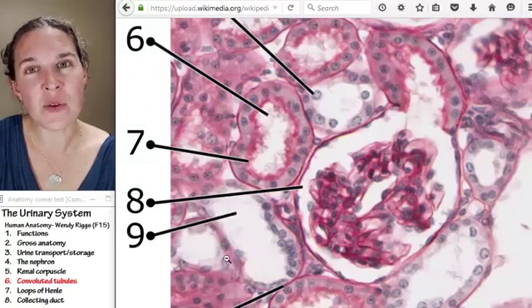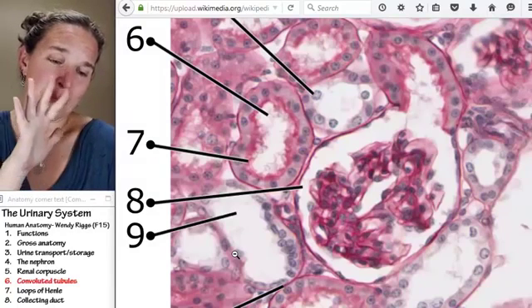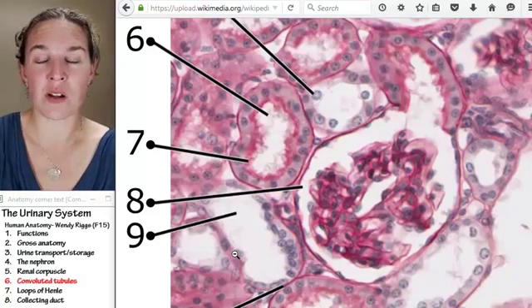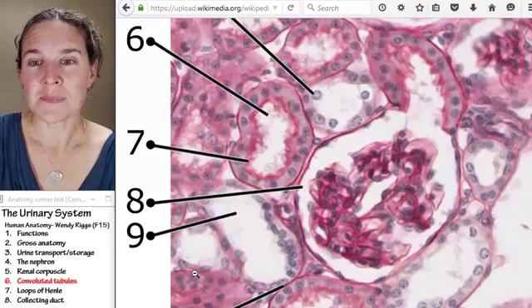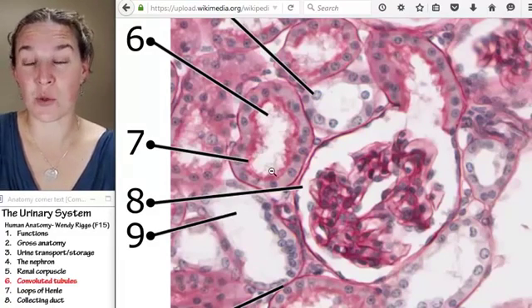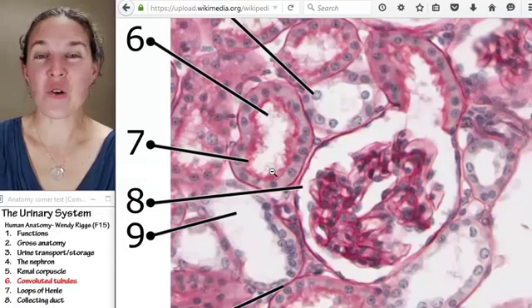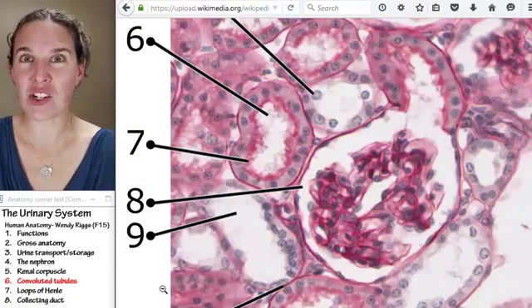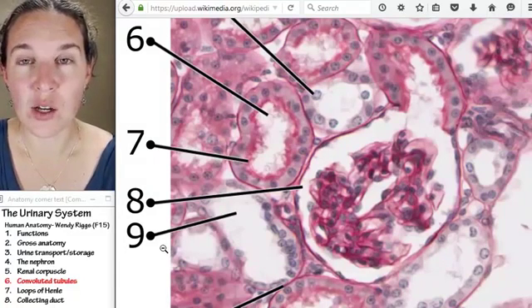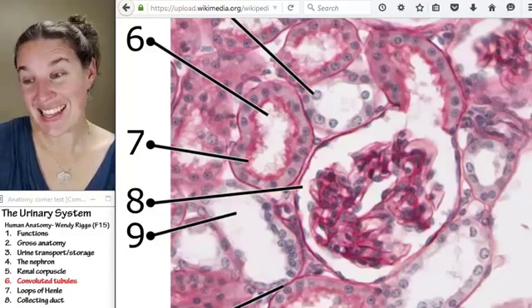Distal convoluted tubule, it still is reabsorbing stuff, and it still is modifying the filtrate, but not doing nearly the action that proximal convoluted tubule is. Okay, so can you tell the difference between them? Of course you can. And make sure when you're in lab and you find some, quiz each other. Really, quiz each other. All right, let's look at what the loops of Henle are like.